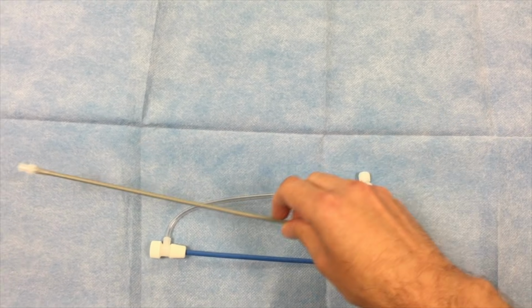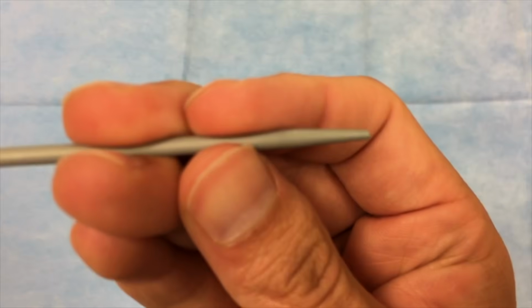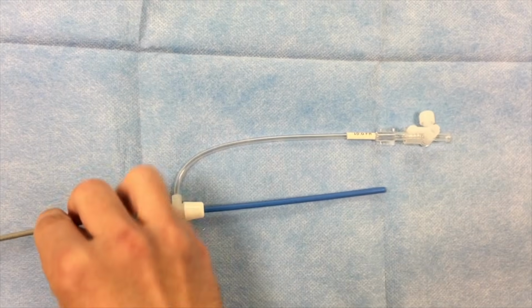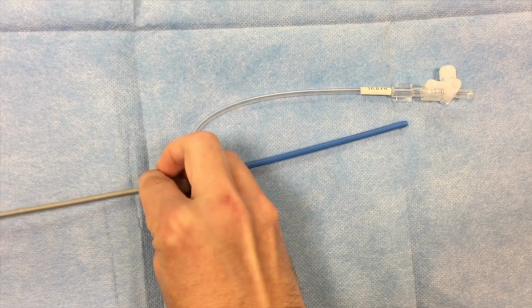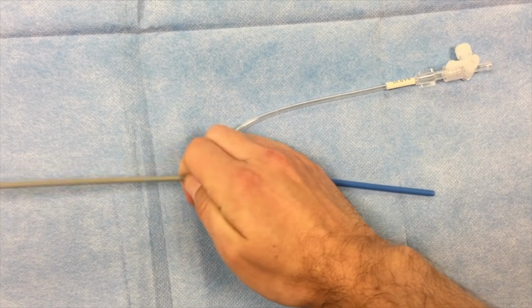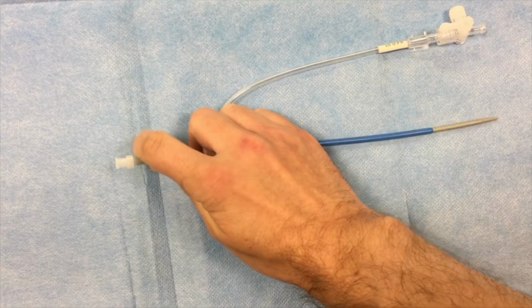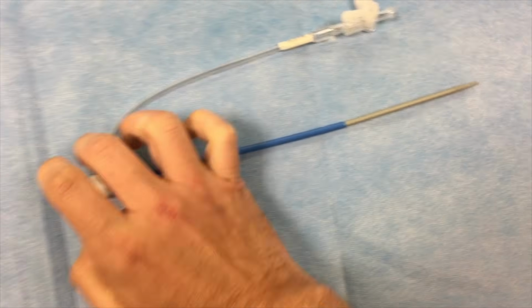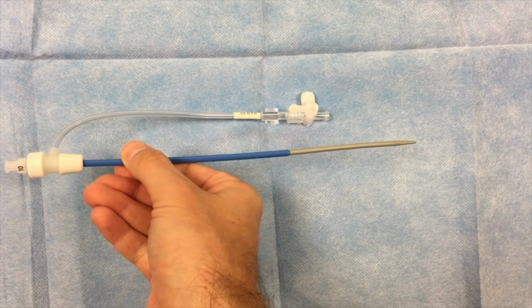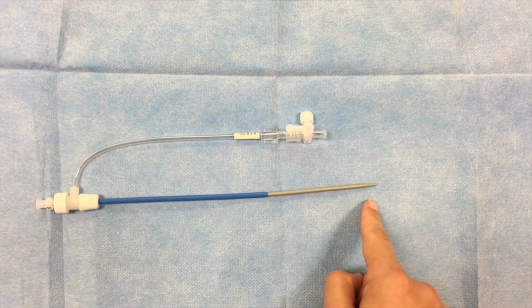This is a dilator, and the way this works is when you're inserting this sheath, you can see the end of the dilator is nice and tapered. It doesn't end abruptly like the sheath does. And basically the dilator goes through here into the sheath, and now you'll see once the dilator is in, the end of the sheath is nice and tapered, and you can enter over a wire into a patient's vessels and it won't traumatize them when it has a nice and tapered end.